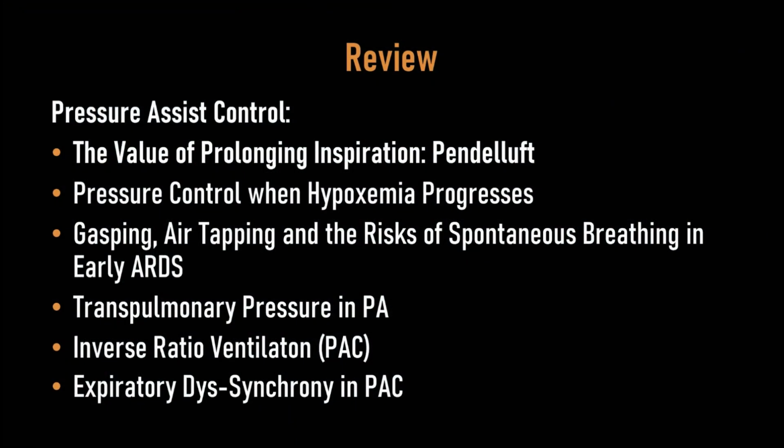Let's review this tutorial. This was the second of 2 tutorials on pressure assist control, and I concentrated on patients with acute hypoxic respiratory failure. I started off with a discussion about the value of prolonging inspiration and the Pendelluft effect, where gas gets redistributed during a long inspiration to areas of lower compliance and higher resistance.